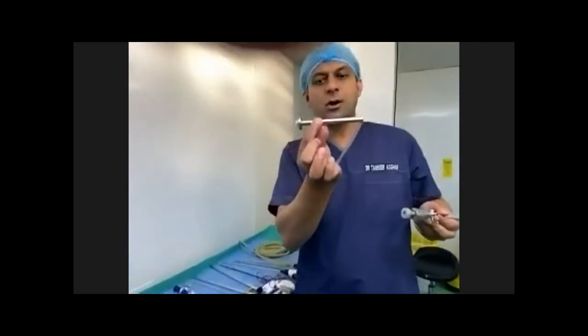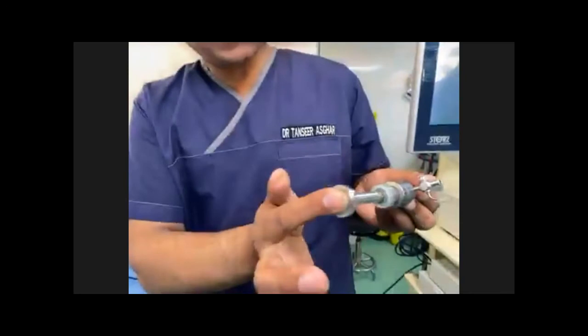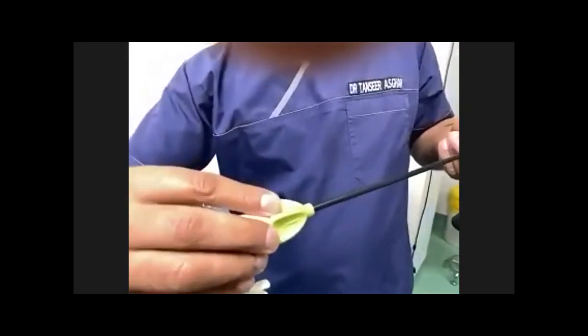So this is called the reducer or sleeve. You put it in like this, put a finger over it so it doesn't leak, and you can very easily put the 5 mm instrument inside like this.